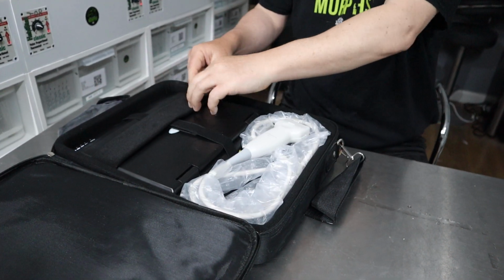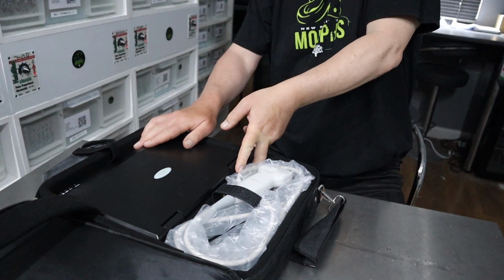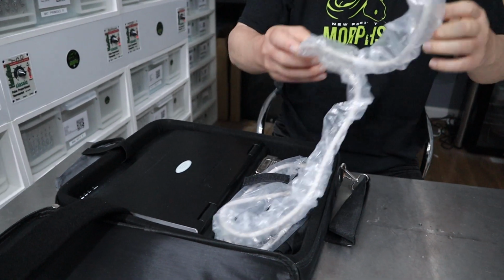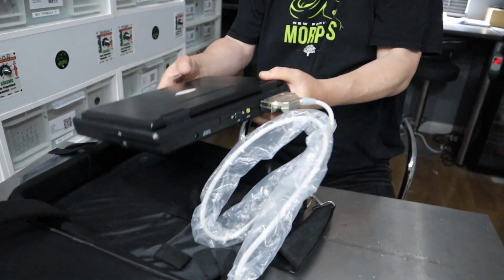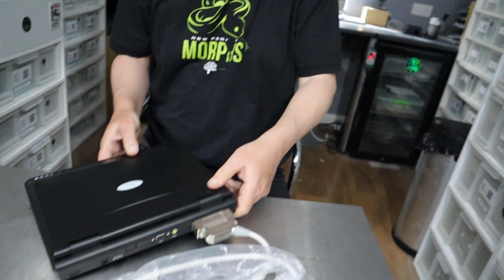And here we have the system here. They come down in price, Joe. They're about £750 to £800 now, if people are thinking about getting one. So we'll just have a look at her follicle size and see where she is. She's got this habit of getting a lot of humidity in her rub. She keeps on spilling her water. So we just don't want her to lay eggs on water, because that would be the worst thing that we could do.